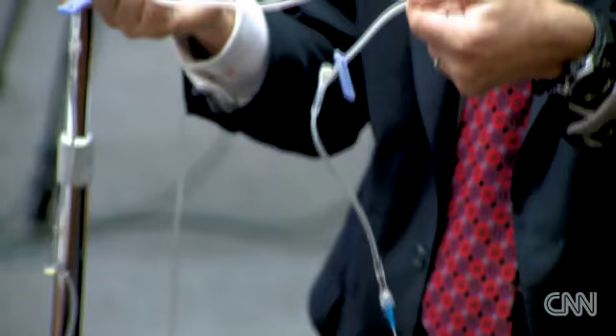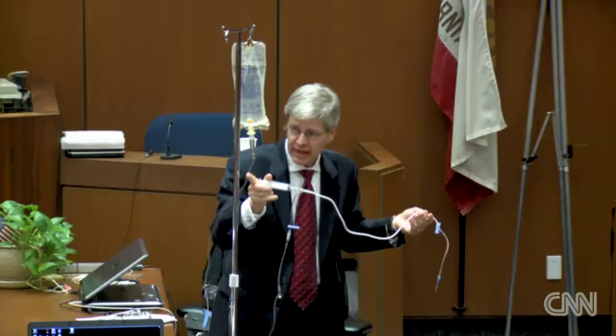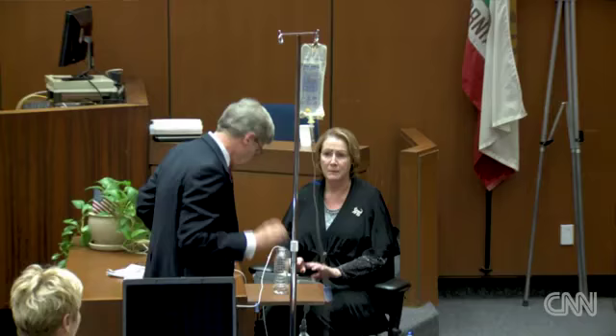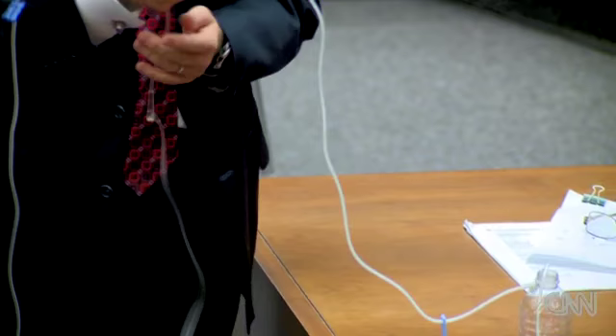Even if I had injected this over five minutes, no propofol has gone to the patient with this particular tubing set. Any anesthesiologist, nurse anesthetist, or anybody familiar with IV injections knows that you don't turn this off, because by turning it off you're preventing the drug from getting to the patient. When I unclamp this, it flows to the patient — but it didn't flow to the patient while this was clamped.